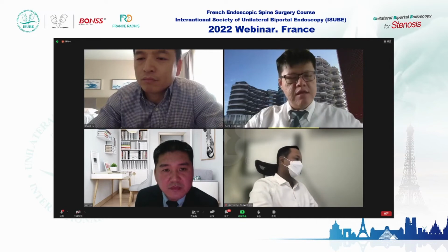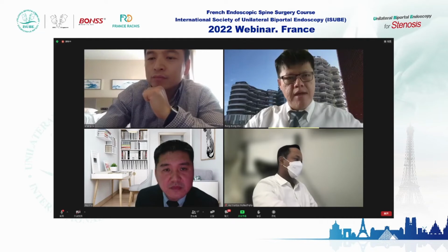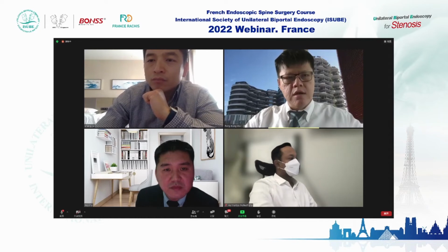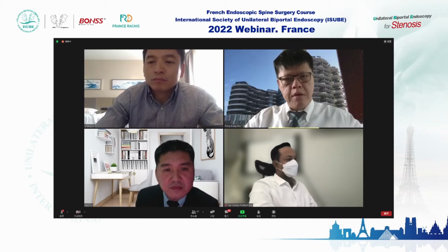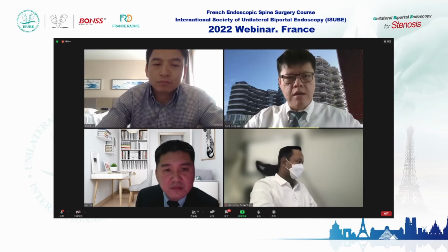Both don't need any revision surgery. For the dural tear, I repair them using the tachosil method. I think we can also repair them using sutures through the biportal approach. These are the complications I've seen in my cases.